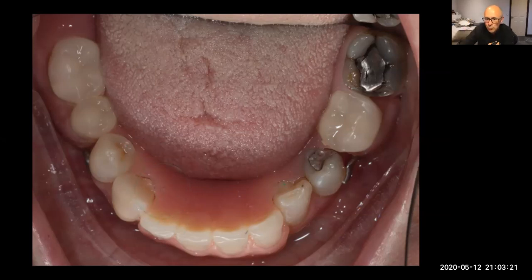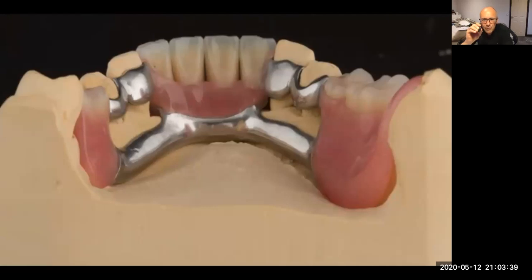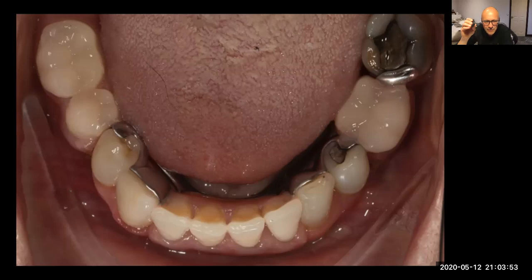And then what we'll do now is let's fast forward to the definitive denture. So here's the chrome that we made for Sandra. And look at the rest seat there. That's lovely. That's going to fit beautifully into our composite rest seat and also the rest seat that we've got underneath that crown there. And this is that Scandinavian design, all open to the saliva. You know, the patient can get a TePe through.